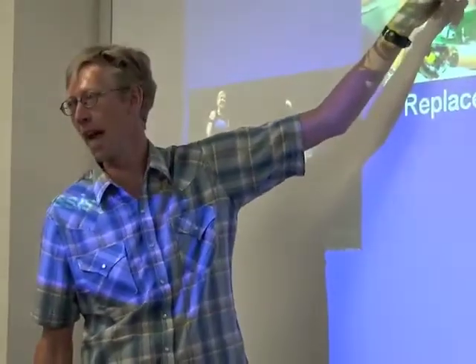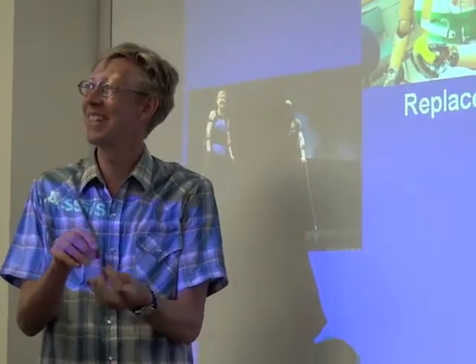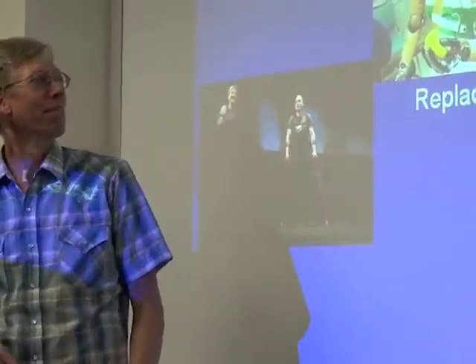And so now you could put an artificial sensor out here on the hand, and then you process that. When he touches something, you process it, and then you put what's called a tactor, which is a little vibration device that could go over the muscle. So he'd feel it as if it's on his hand. So it was a real breakthrough in prosthetics. People still kind of don't like to wear them. It's still really heavy. It's hot and heavy, and you have to put the electrodes on. So there are still limitations. But the fundamental idea of giving more degrees of freedom has been a breakthrough.